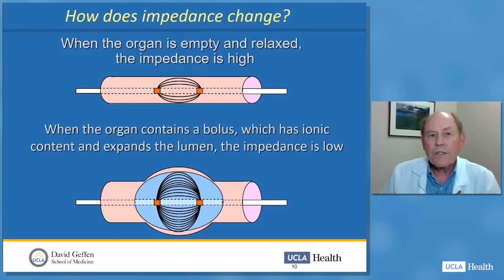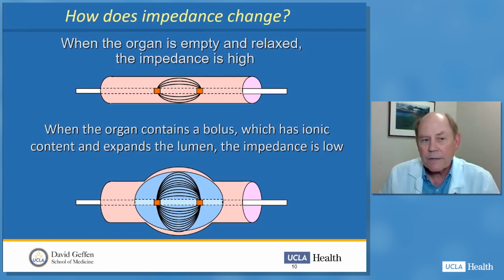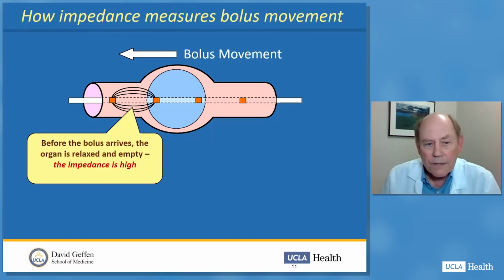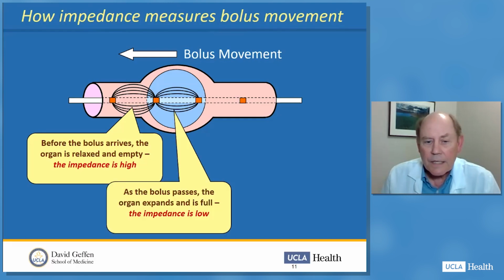So how does impedance change? Well, when the organ is empty and relaxed, the impedance is high. And when the organ contains a bolus, which has ionic content and expands the lumen, the impedance is low. So, as the bolus moves along, ahead of it, the impedance is relatively high. In the bolus, as it's moving along, the organ expands and is full, so the impedance is low.